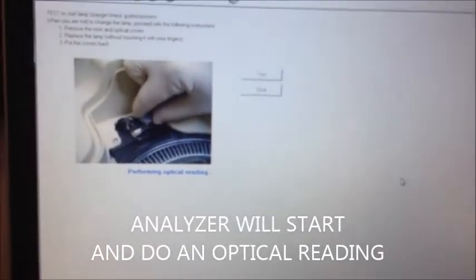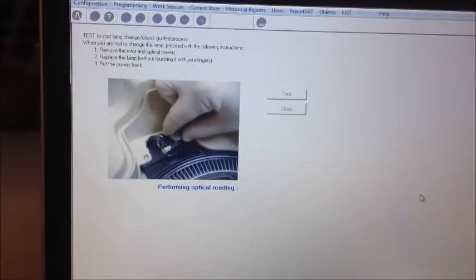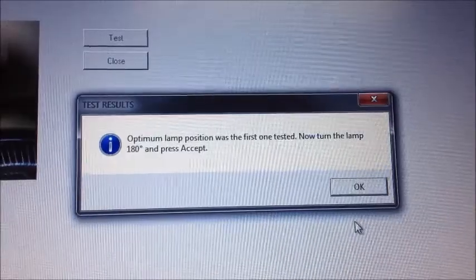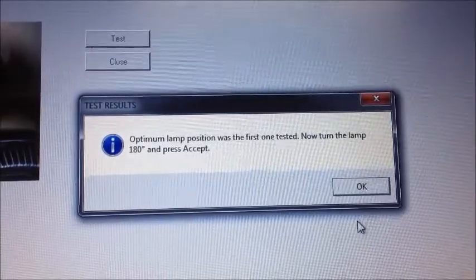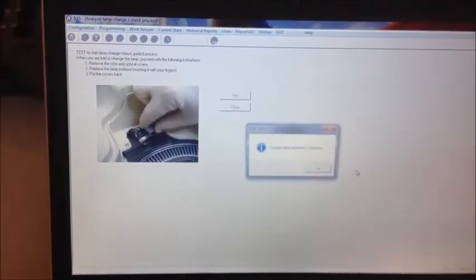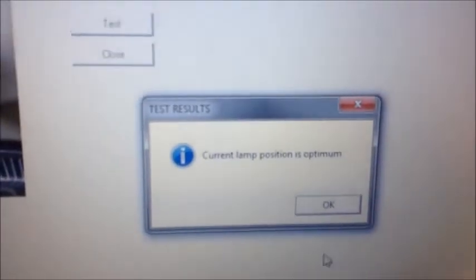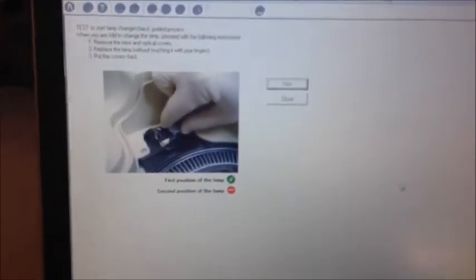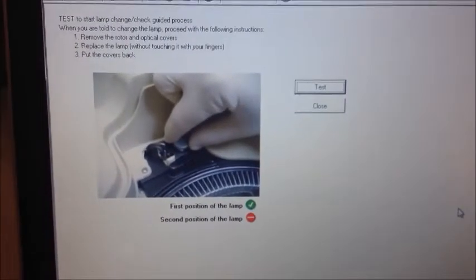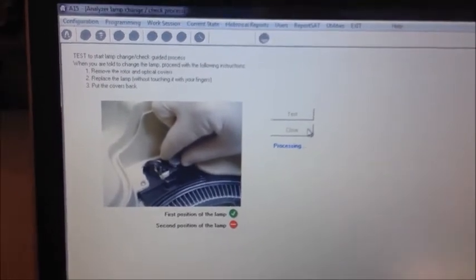The analyzer will again perform an optical reading to establish the optimum position for the maximum performance of the lamp. When finished, click Close to go back to the main screen.